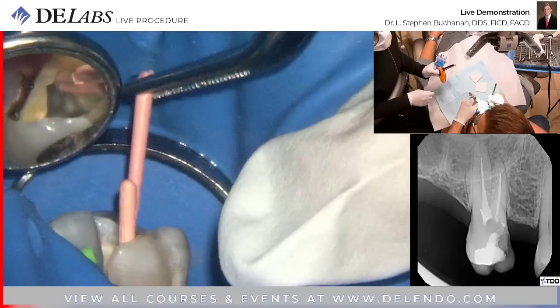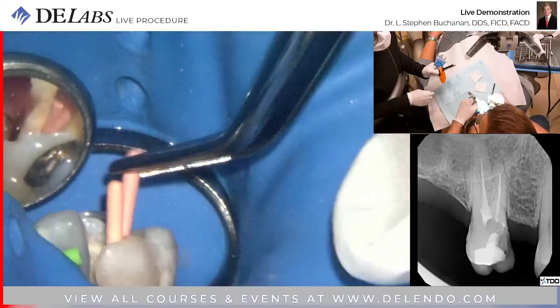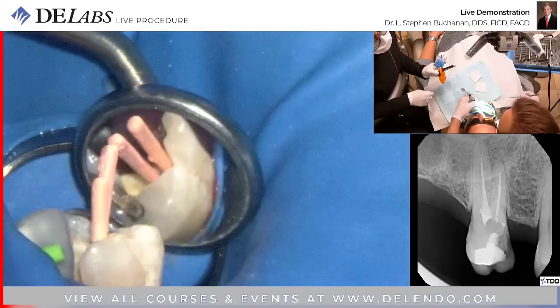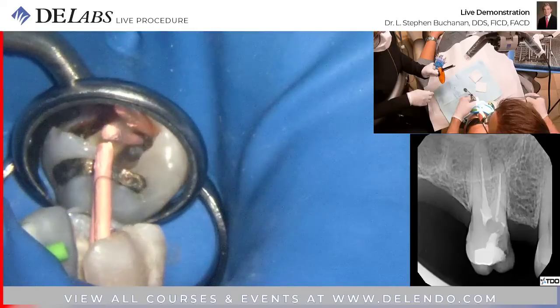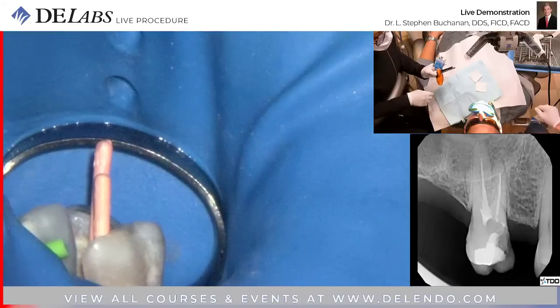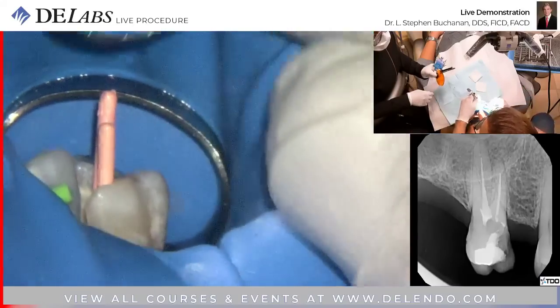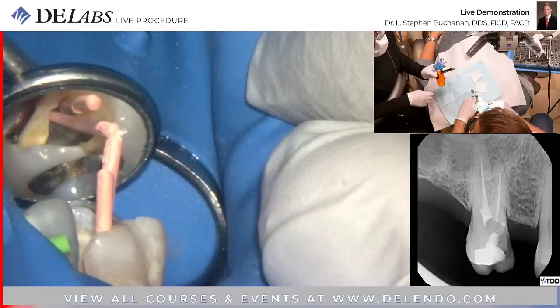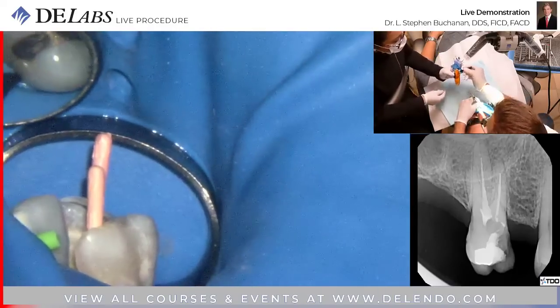as I create this. What are you putting on there? I'm going to put Cool Dam. Are you putting something on the cones? No, on the mesial surface of the tooth. Okay. Yeah. It looks like there's something on the cone. You're sticking it in. Huh. Okay. Dust. Got a perch of dust.